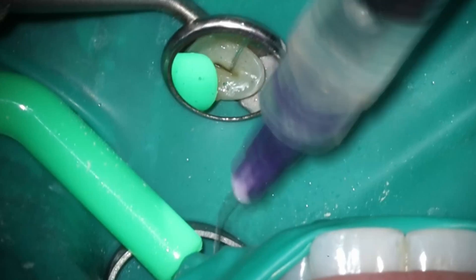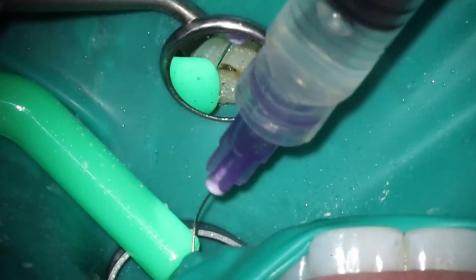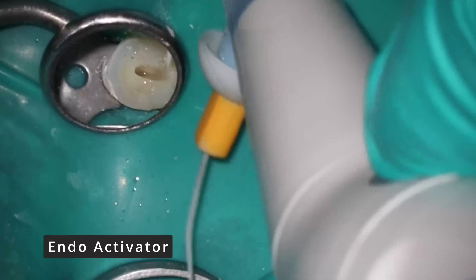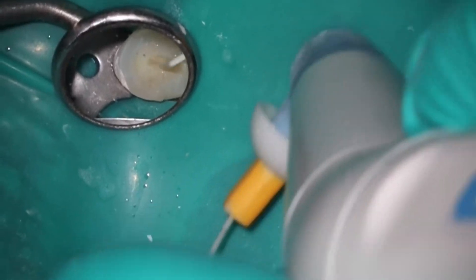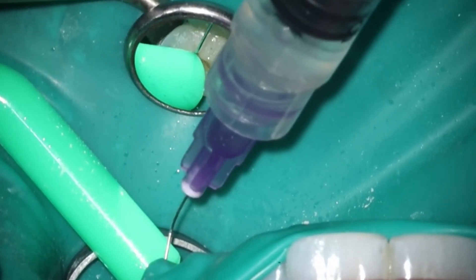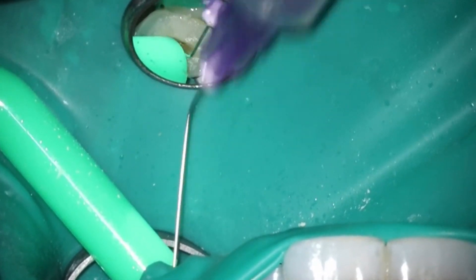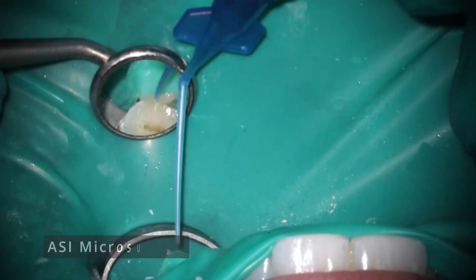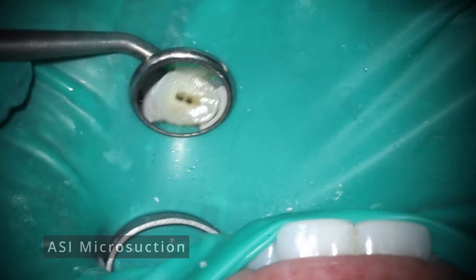Do I think the activator makes a difference? I do think it makes the final X-ray look prettier. Back in residency — about 10 years ago — I did notice a difference in the quality of the final image when I used an activator. It doesn't take long or cost much; we get the tips from eBay. It takes maybe 5 to 10 seconds to get things a little cleaner. After my last video where I said bacteria don't matter — bacteria don't matter until they do. If you want a full video on my thoughts on bacteria and biofilms in endo, let me know; that'll probably be a lecture to the residents since it'll be a longer one.